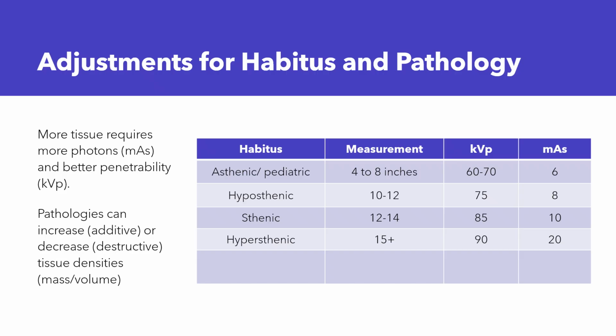And so there's a lot more gas in the abdominal cavity than there usually is. Well, bowel gas is air, and it's one of the easiest tissues to penetrate. And so if you're swollen up with air because you're obstructed, the x-ray tech actually needs to reduce the kVp when you have small bowel obstruction, ileus. Okay.